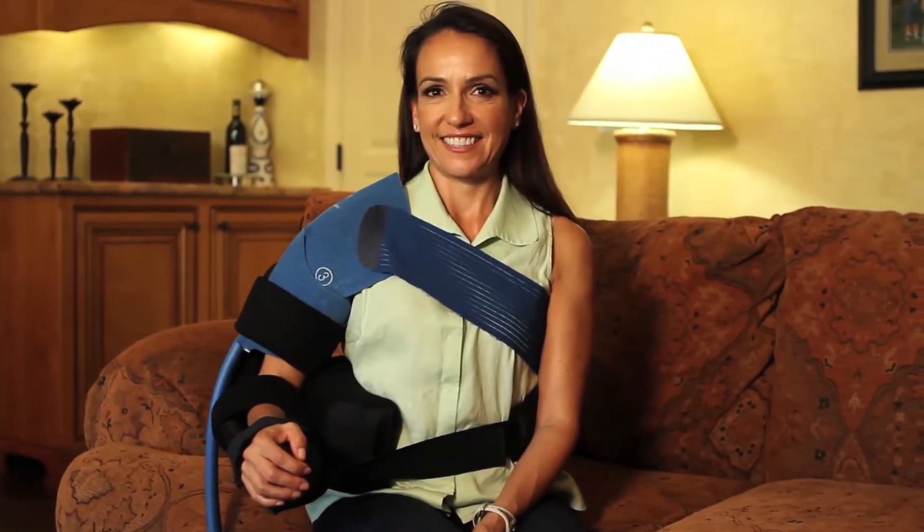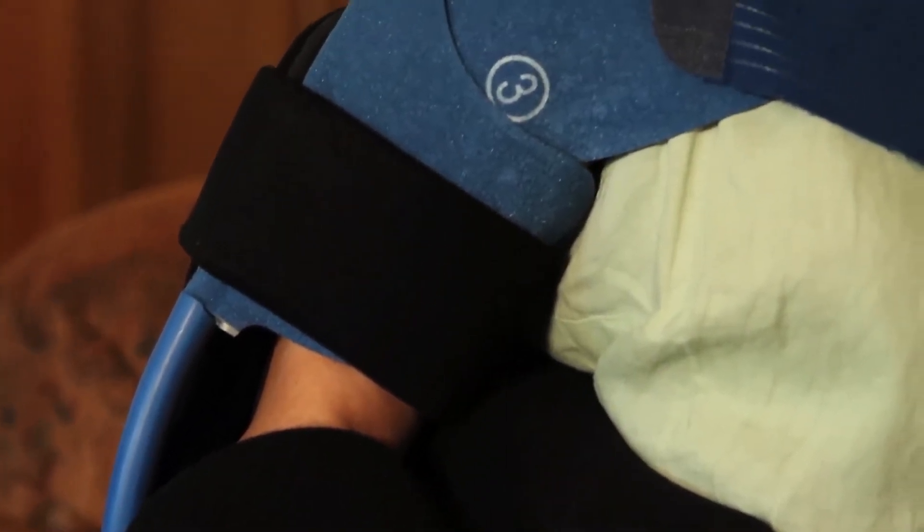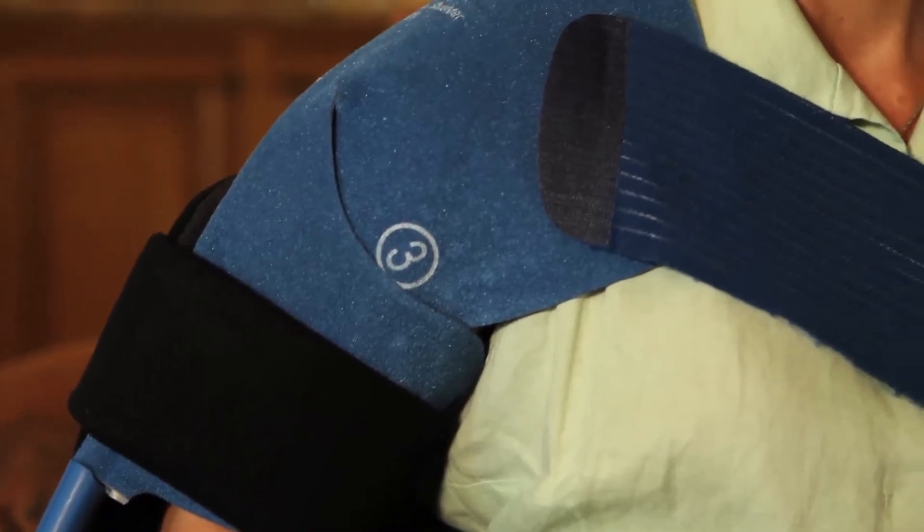The shoulder cradle is designed to easily accommodate cold therapy systems if your physician has prescribed it. Simply place the cold therapy pad prior to closing the upper arm strap.